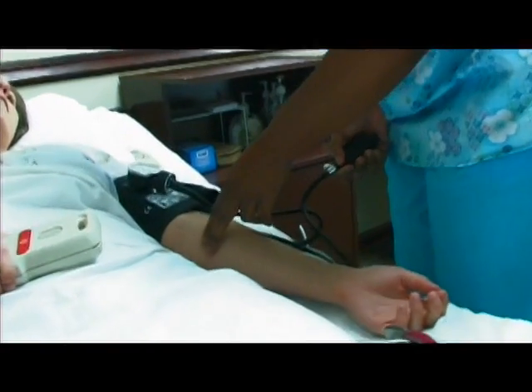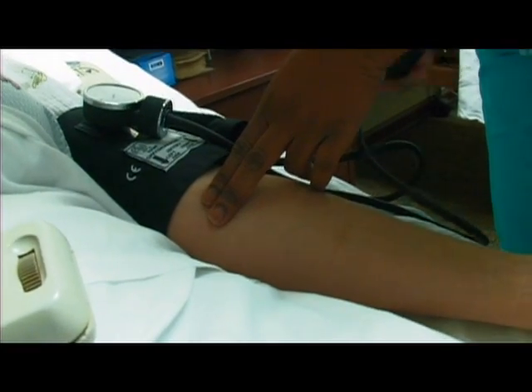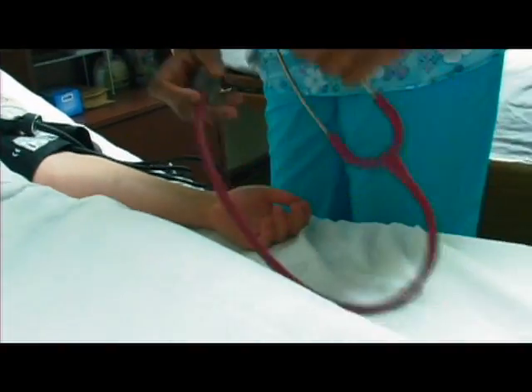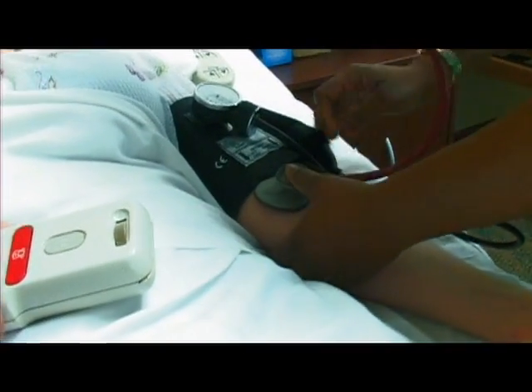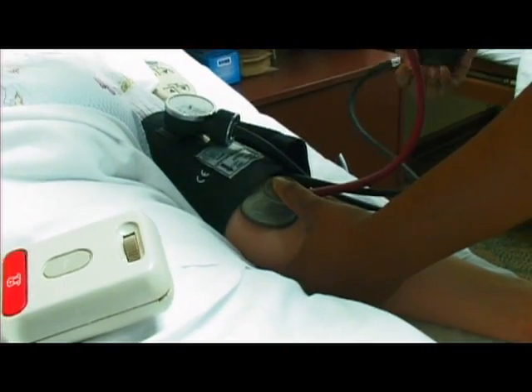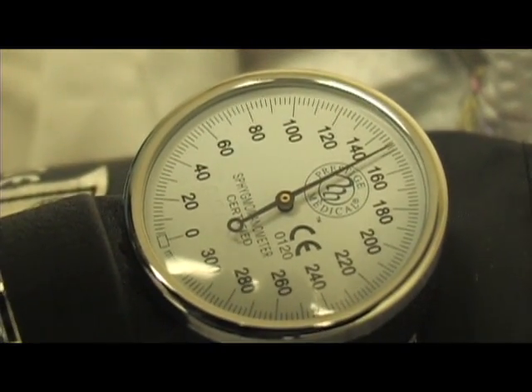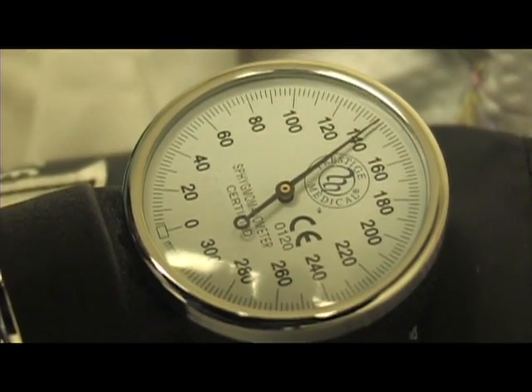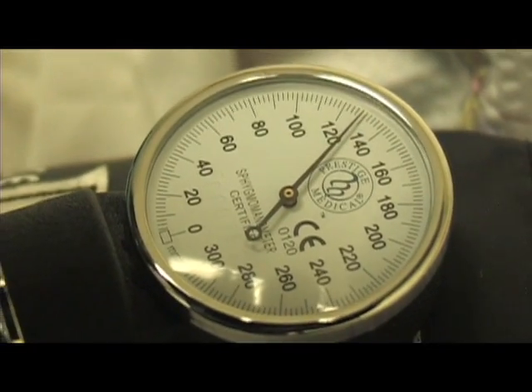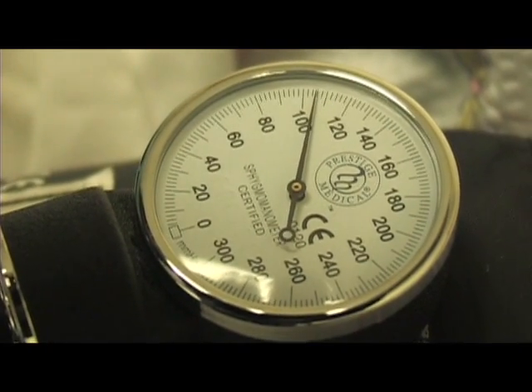From the pinky up, locate your brachial artery — this is where you want to place your stethoscope. Safely inflate your blood pressure cuff. For your first blood pressure, do not go above 160. Slowly decrease the pressure on the cuff. The first thump you hear is called the systolic blood pressure.